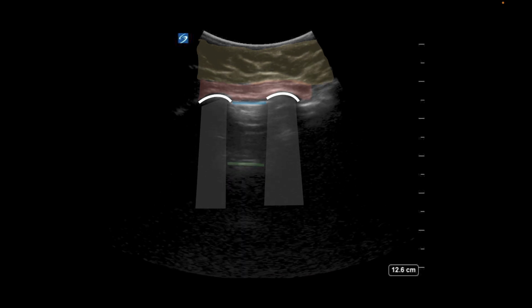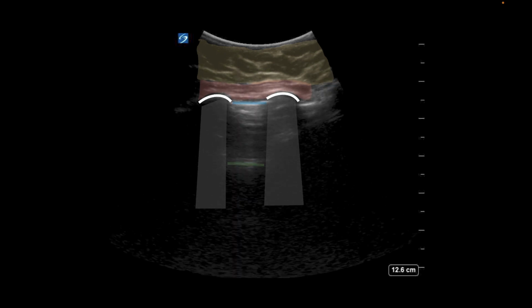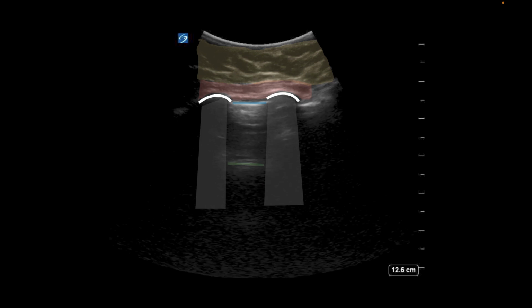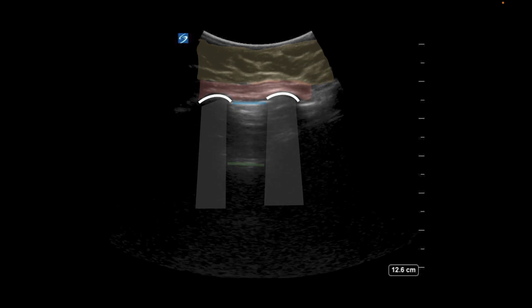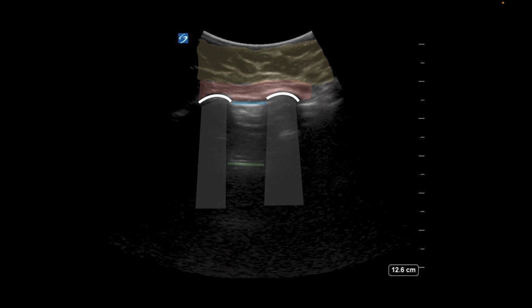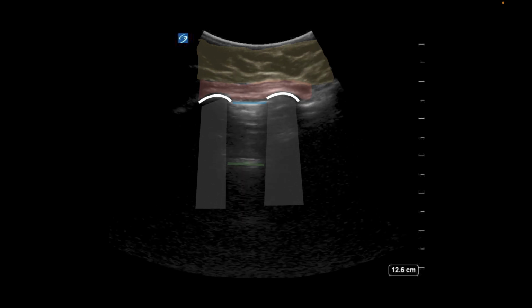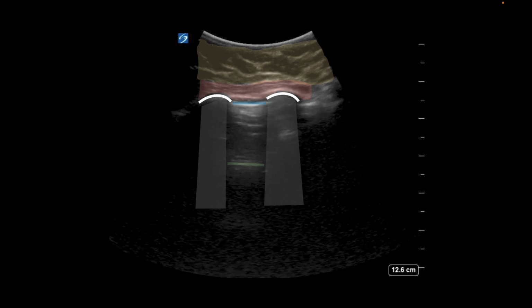To ensure optimal imaging, gain and depth must be appropriately set to the pathology you're evaluating. For instance, when assessing B-lines and lung parenchymal pathology, your depth generally should be set to about 12 to 18 centimeters, aiming to place the pleural line in the focal zone. However, if you're concerned for pneumothorax, your depth should be decreased to really focus on the pleural line as the structure of interest. For gain, this should be optimized to where your pleural line is distinct and rib shadows are anechoic. Note that this might be lower than the machine preset for lung ultrasound.